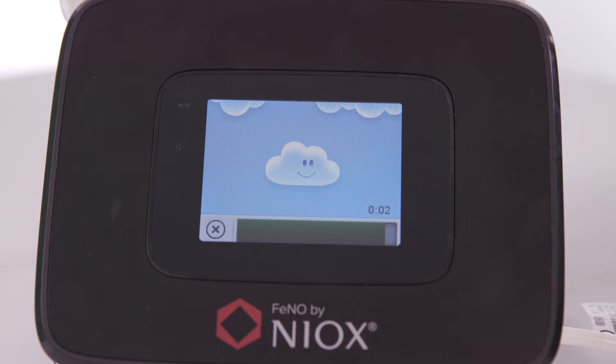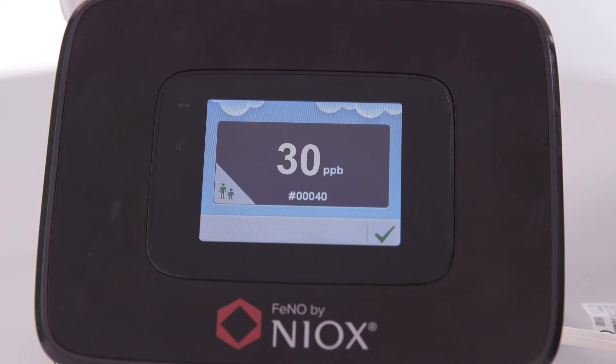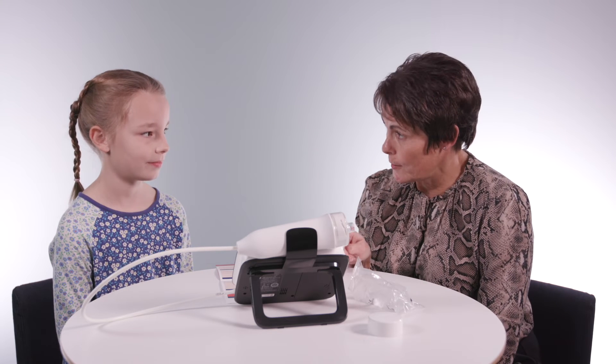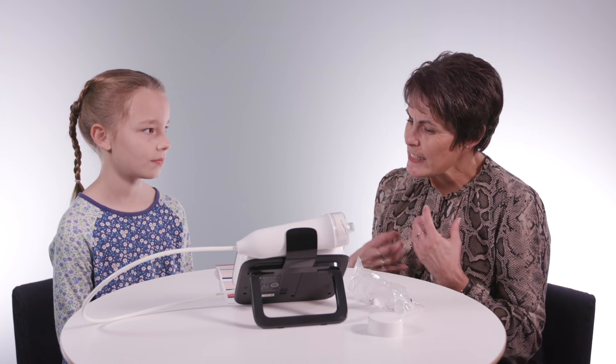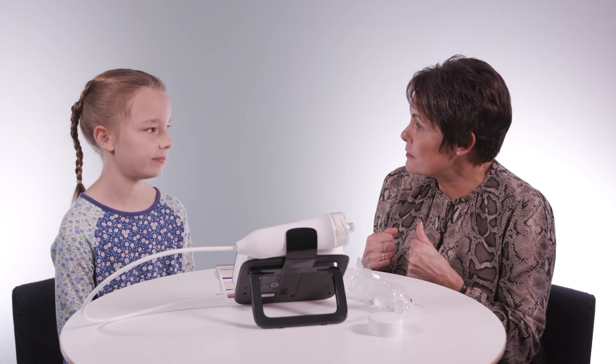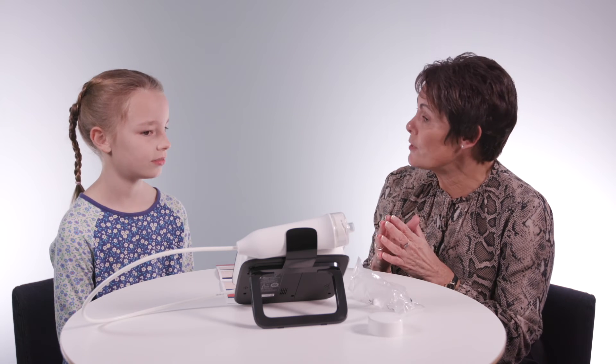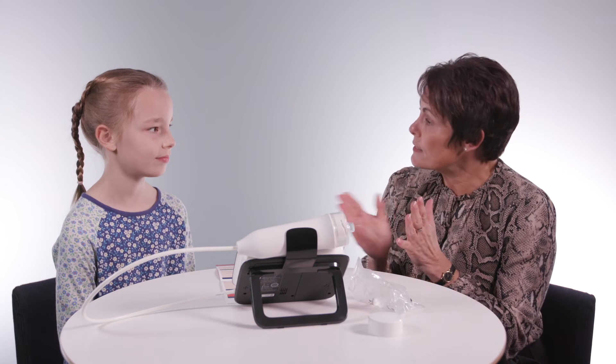So we've got a couple more seconds to go — and there we go. So what we can see, Charlotte, is your number is 30. That's telling me that inside your breathing tubes they're a little bit red at the moment, a little bit angry. So we've got to get some medicine down there to settle all that down. The next step will be to show you some different inhalers and see which one is going to be the best for you. I'll give you that to take away and then ask you to come back and see me in a few weeks and see how you're getting on.